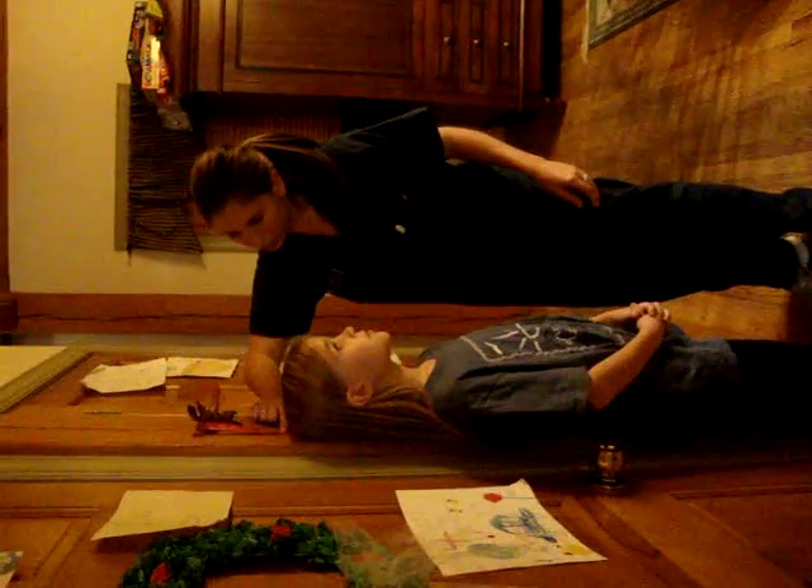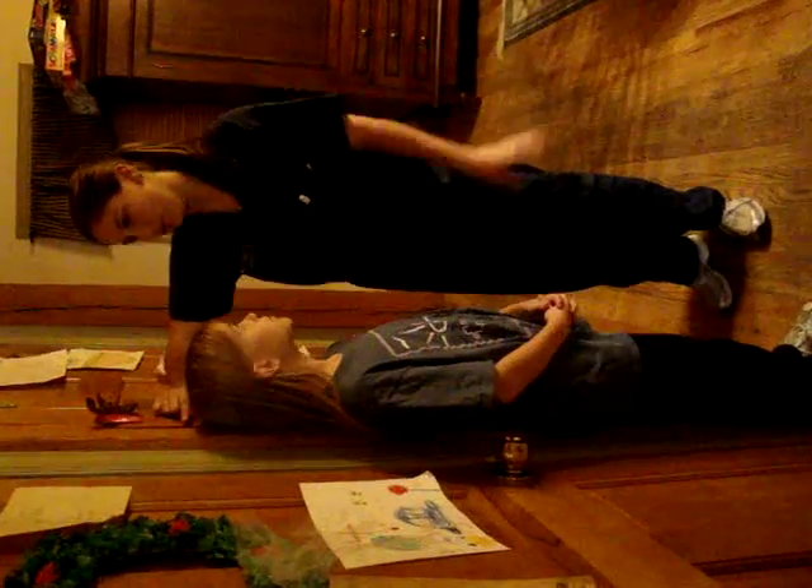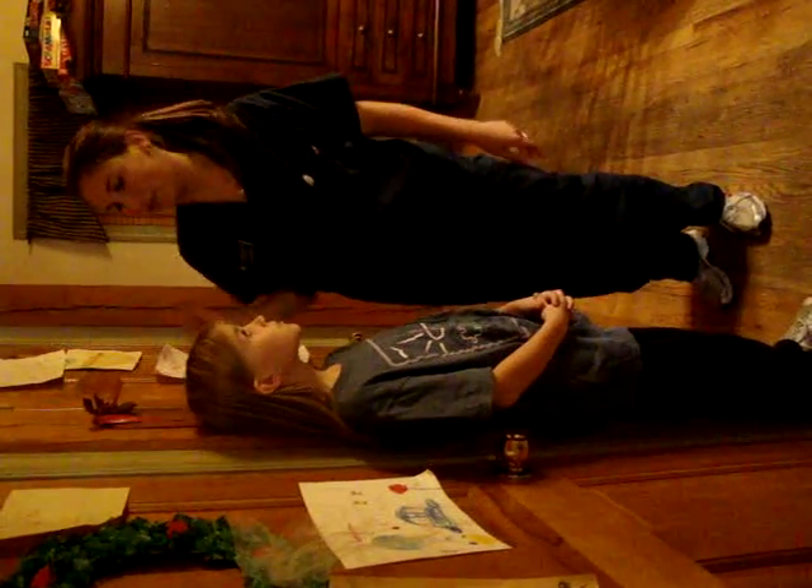Now come over here. I'm going to measure your height. Usually you'll have to take your shoes off, but that's okay. About 55 inches. Write that down.